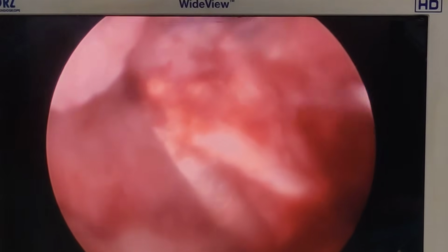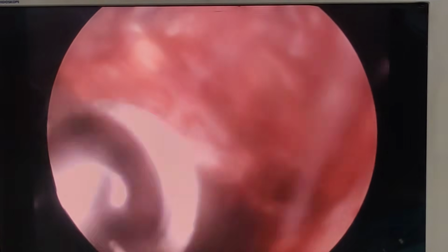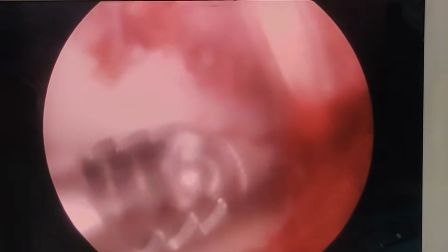Now look at this beautiful creation of us. So this is a nicely created posterior cruciate ligament. I'm just going to give it a good wash. I think I've already shown you, but do spend some time clearing the debris. And usually at the end I put my scope in the suprapatellar pouch, and this was the trick that I learned from Mr. Ajay Adhikari, who was in Epsom, to give it a good wash in the end before you close the knee. Any procedure, even if you do a meniscectomy, take it in the suprapatellar pouch, give it a squeeze in the popliteal fossa, and then come out.